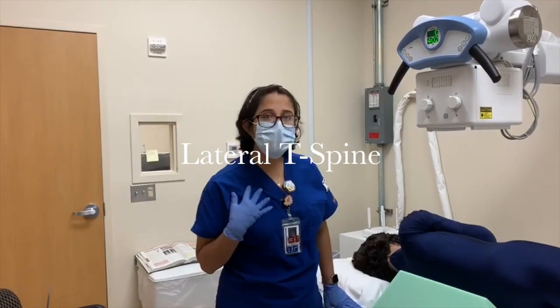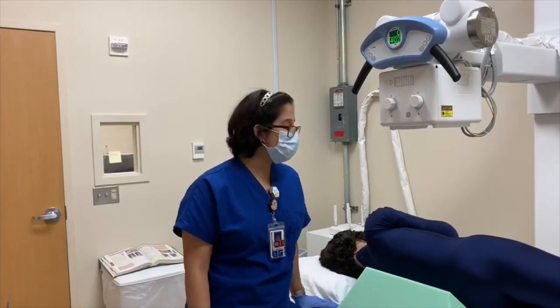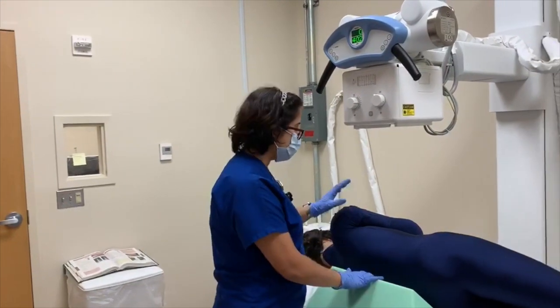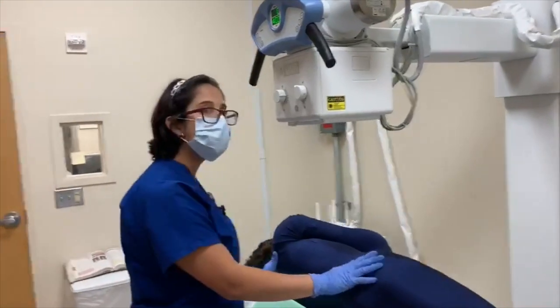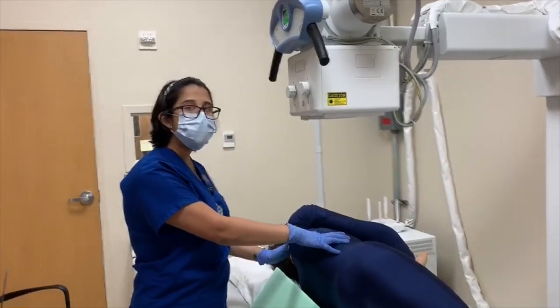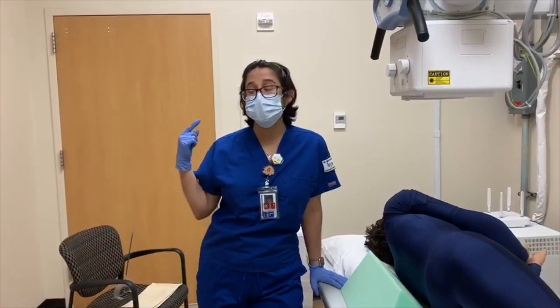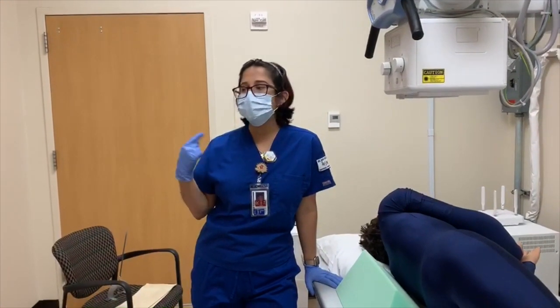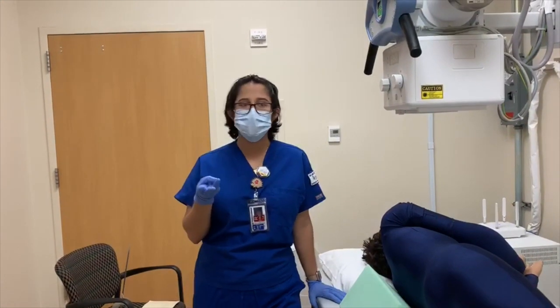Hi guys, so my name is Liliana Juarez. I'm taking over Camille's exam. So now after the posterior obliques, we're just going to roll her back into a true lateral for the lateral T-spine. The lateral T-spine is to show any thoracic spine pathology such as compression fractures, kyphosis, or subluxation.